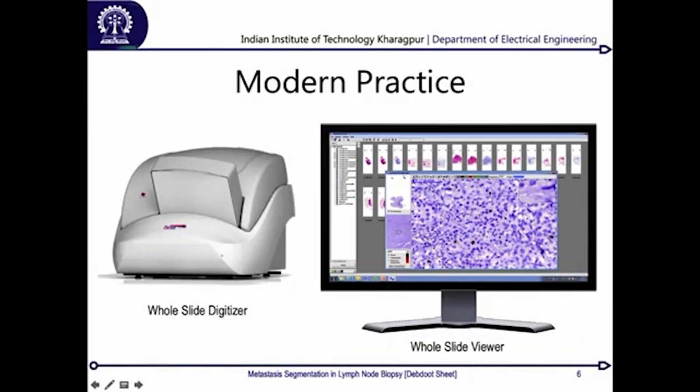This is what is enabling telepathology in today's world, and it no longer restricts you to sending your samples physically to a different city. A collection center in your small city or a rural place can collect your sample, make it into slides, and digitize everything, and then the super specialist pathologist, who may be located at some other nodal center in a major metropolitan city, can still do the reporting without you having to travel, or your samples having to travel to that major city, which has other risks of sample degradation as well. So now that we have this kind of a major solution available, it should really make our lives much easier.